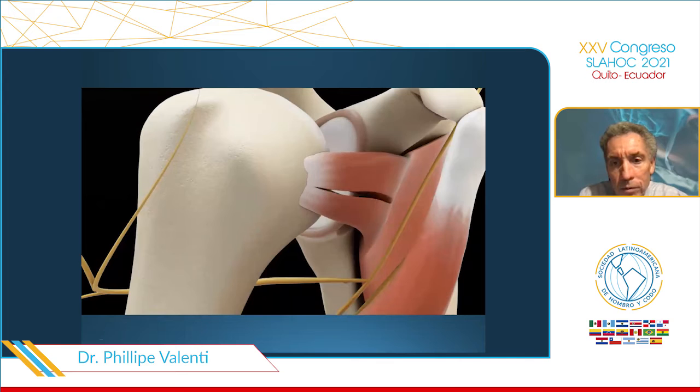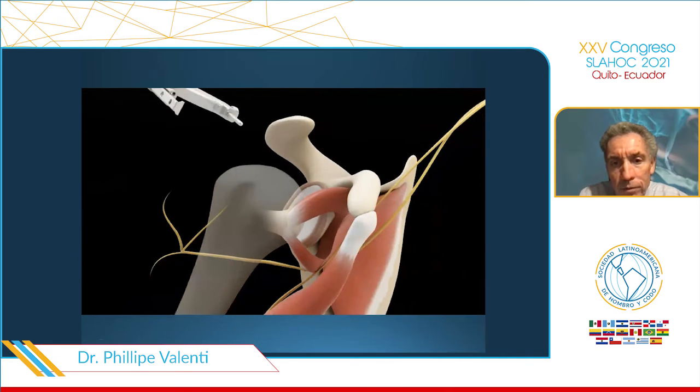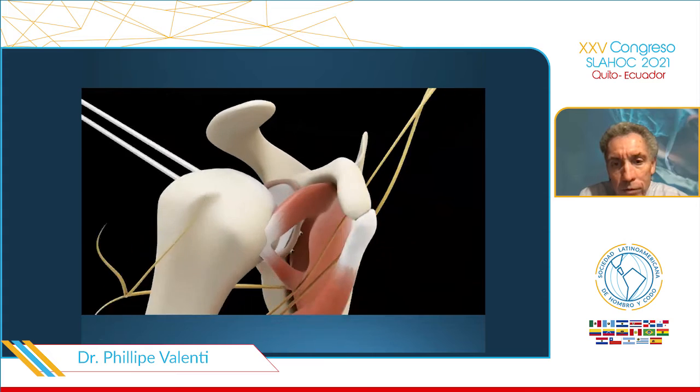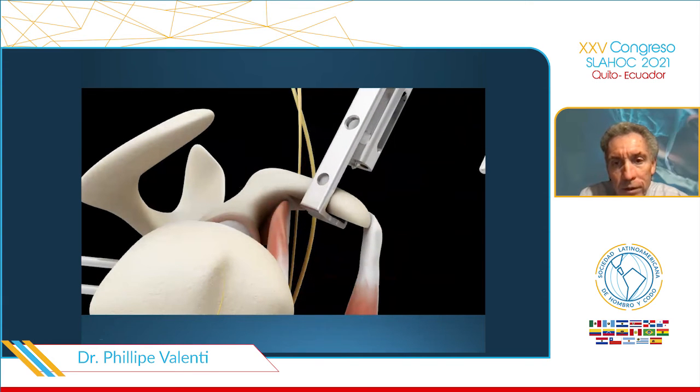So we do a split of the subscapularis. We use a spreader, and with a posterior glenoid guide, we do 2 holes with a 2.9 drill from posterior to anterior. With the same distance, using the specific coracoid guide, we do 2 holes with a 2.9 drill.